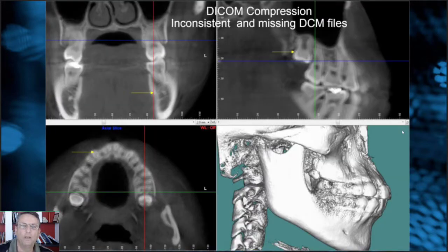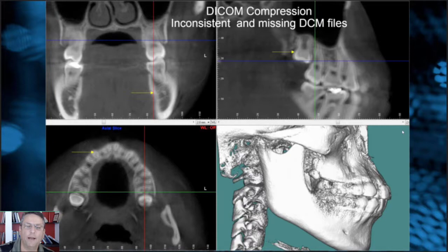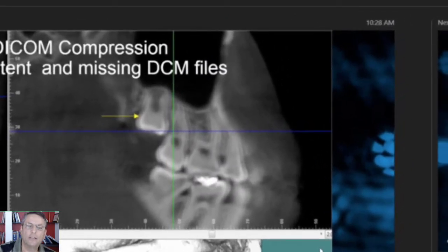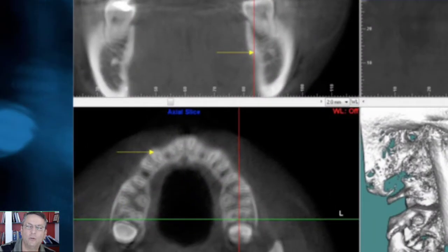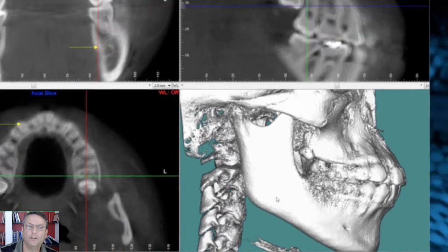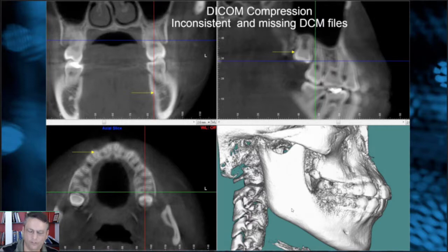One of the things that can happen is when we compress the DICOM, the computer will take all the individual files and compress them to a smaller file format. This particular file that I scanned — when I reloaded it, it made it look like there was patient motion artifact. It's fuzzy. It looks like a blurry image, as you can see with the yellow lines. But if you look at the 3D volume render of the patient's jaws, it's really smooth and clean. What happened is when the data was compressed, it became inconsistent.